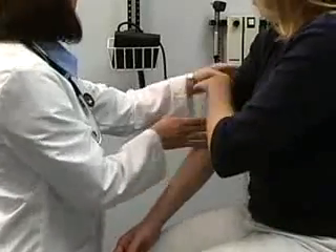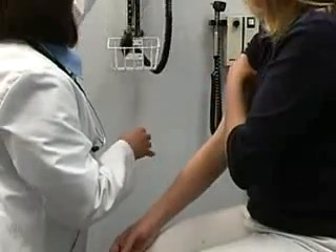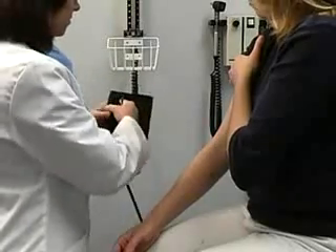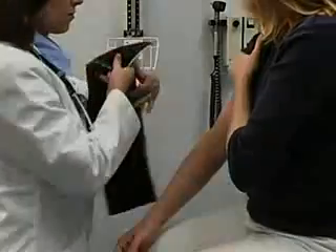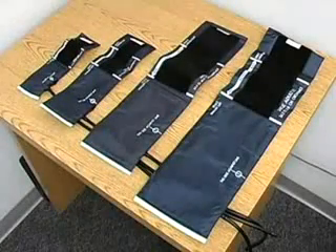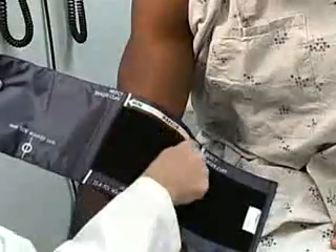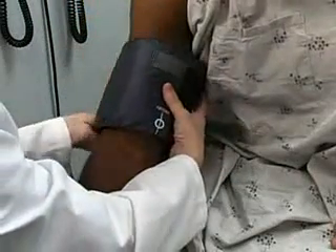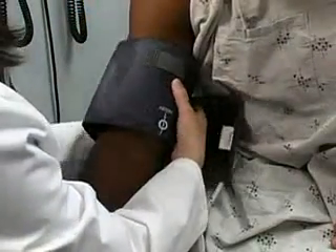To assess blood pressure, you must first select the proper cuff size. Sizes range from infant, child, adult, to large adult, or thigh cuffs. An appropriately sized cuff will fall within the range demarcations when wrapped around the patient's arm. Cuffs that are too small may give falsely high readings.